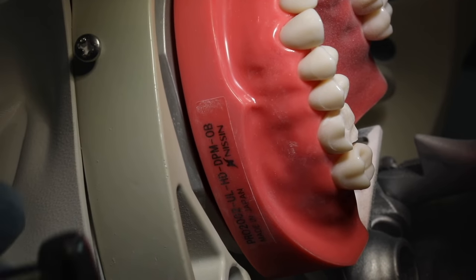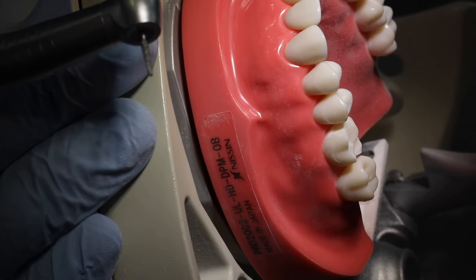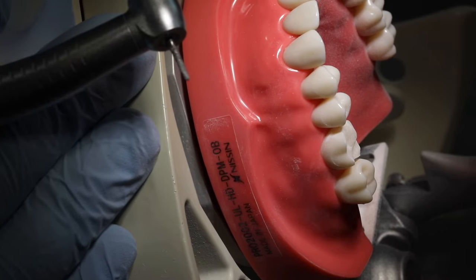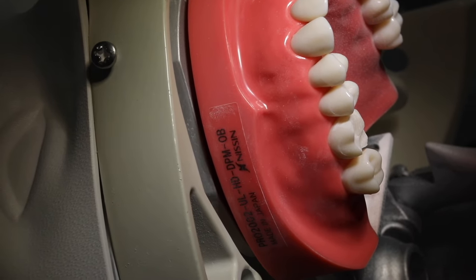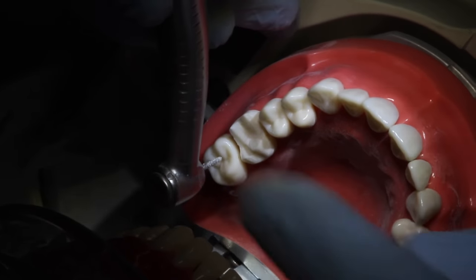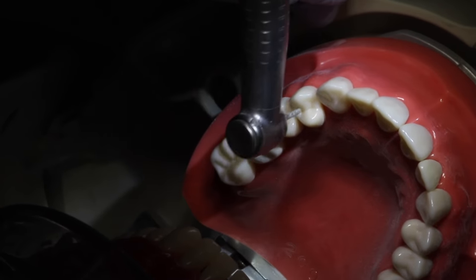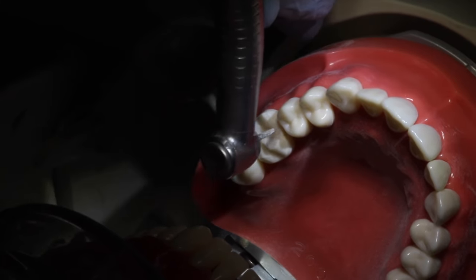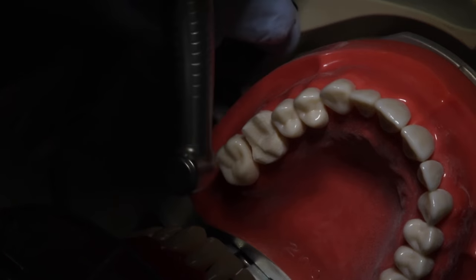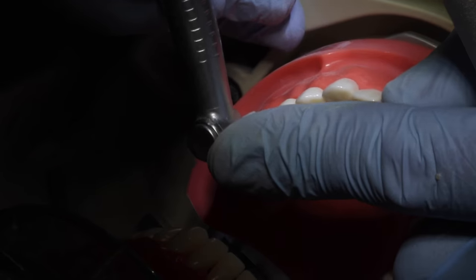Now, these upper molars, the axis goes a little bit out to the buccal. And so it's just the opposite of the lower molars. And so we want to maintain that in the axis that we prepare into this. We'll start on the buccal surface, but the way we'll key is off of the unprepared tooth behind. We'll try to pick an axis that seems to line up with that tooth and all of the teeth in the neighborhood. It's going to go out to the buccal just slightly, and then we'll come to the buccal surface and begin our preparation.